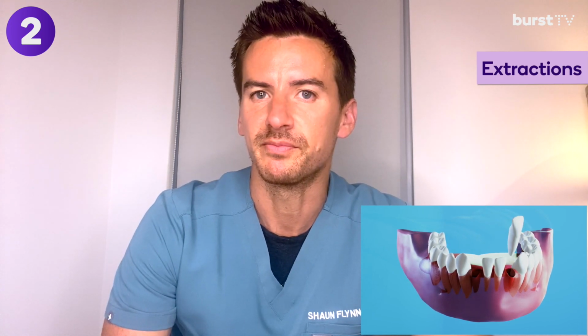Okay. Now, step two is the extraction of a tooth, if there needs to be. If there is a tooth that needs to be extracted, this will happen next. Depending on the case, this can be done before the implant placement, or sometimes it can actually be done at the same time, so the dentist can actually extract the tooth and then place the implant in the same day. Now, during the actual extraction procedure, the dentist will obviously anesthetize the patient and then extract the tooth and give them the post-op instructions.